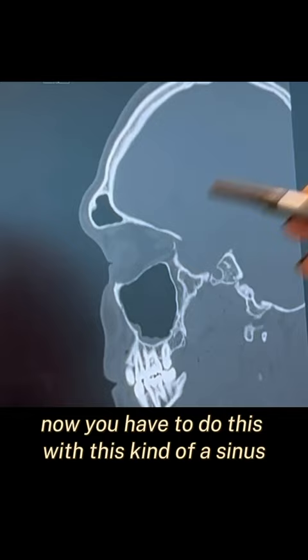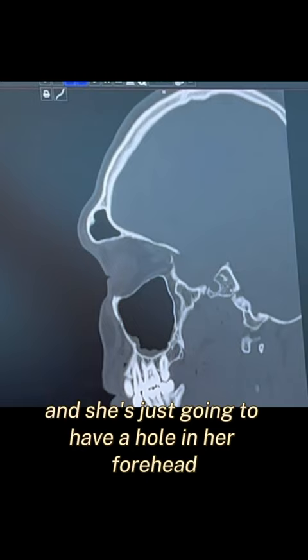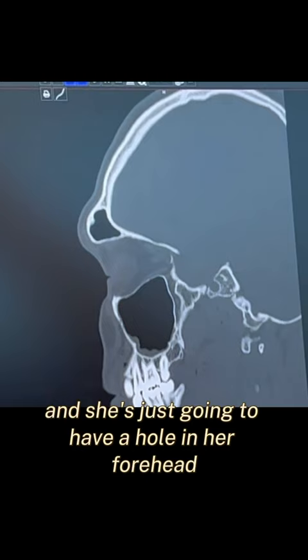I'm gonna put it back on in a more flat position. Now you have to do this with this kind of a sinus because you can see how thin this is — there's not enough bone here to burr down. If I just try to burr this, I'm gonna burr right into the sinus and she's gonna have a hole in her forehead. So this is why type 3 is usually the recommended surgery for most patients.